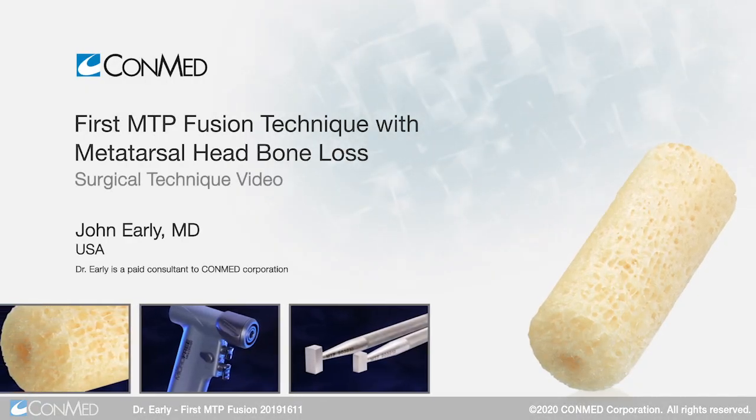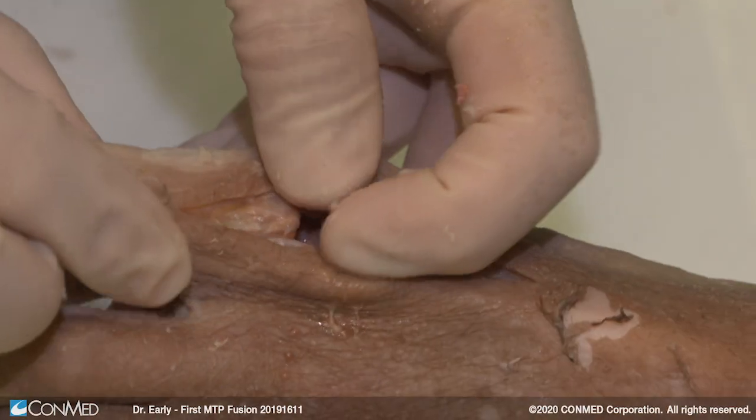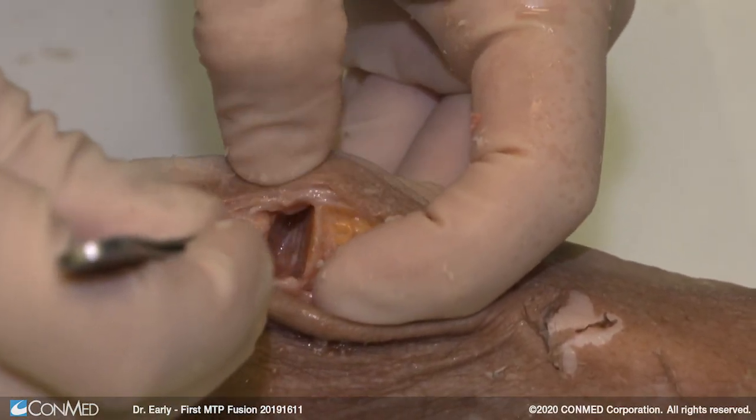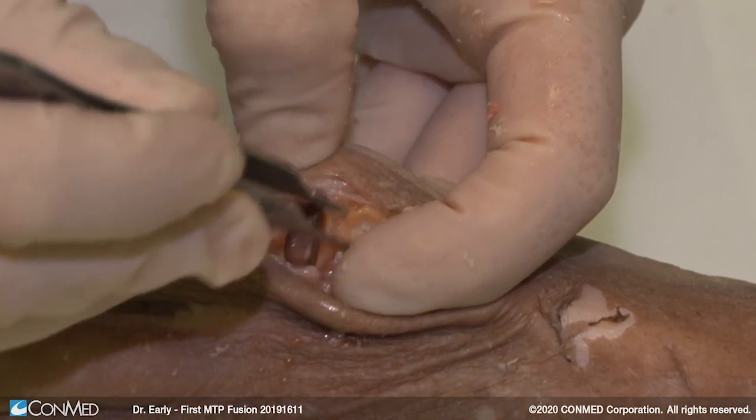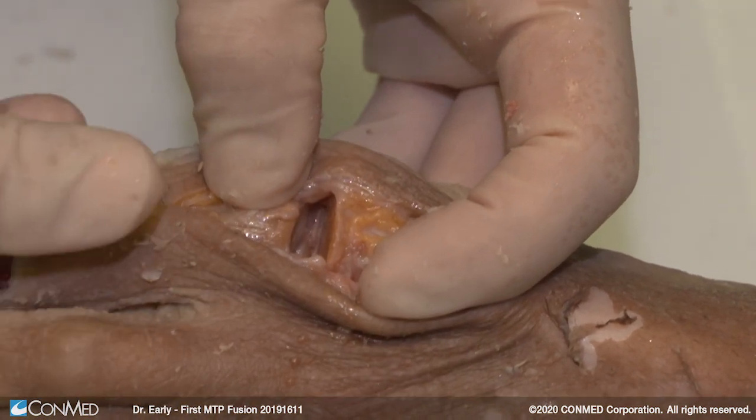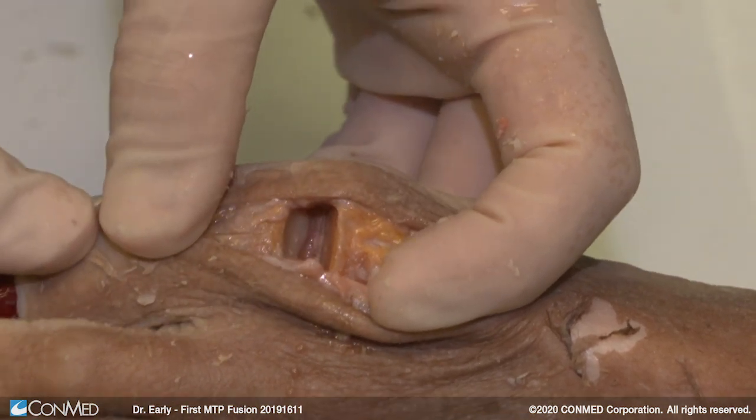We've taken out the metatarsal head to simulate bone loss for the revision. What we're going to do is use the revision dowel to bridge this gap between the proximal phalanx and the first metatarsal, but also anchoring it into each bone so that we create a stable construct for our implants.